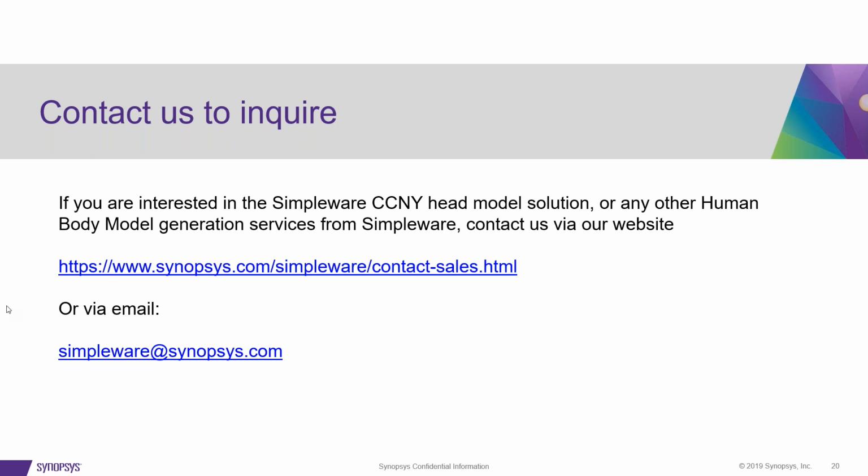Okay, just having a look at the questions here. So how representative is the subject? Do we know the percentile in terms of head measurements? Yes, so we have all of that information. If you contact us regarding the head, it's something we'd be able to give you. Unfortunately, I can't disclose the specifics of the head right at this minute. I don't have that information available, but we certainly do know all the details of the subject that was scanned, so we can tell you exactly where they fit in terms of the population.